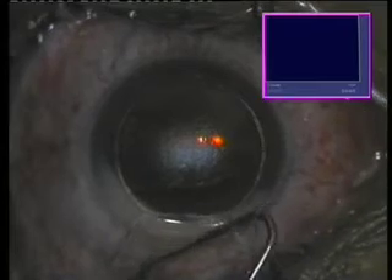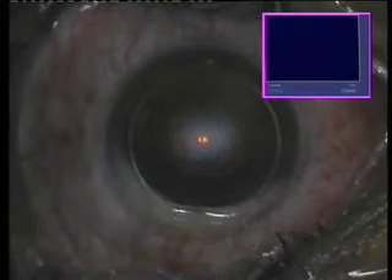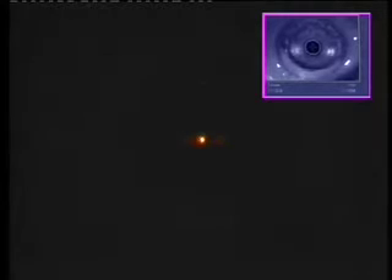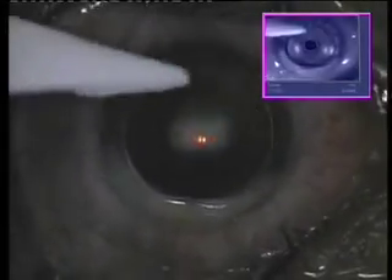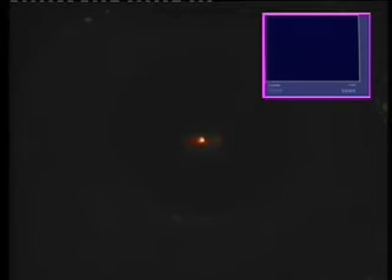We have published in the past our experience with standard hyperopic treatments with this technology. You can appreciate here this flap being centered over the pupillary center, in opposite fashion to the right eye we saw previously, where the flap was significantly de-centered nasally. The laser will now be centered over the stroma and the hyperopic correction performed. We can see the milieu of hyperfluorescence from the laser spots landing onto the stroma. I utilize a dry technique, obviously built into my nomogram. We can see already the ablation pattern — a perfect circle around the pupil. The 4.5 diopters of hyperopic correction with a 6.5mm optical zone is completed within 35 seconds with this technology.